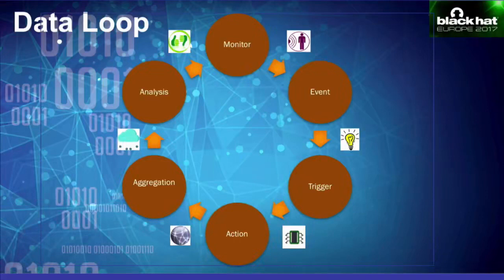That data is then passed on to something called an event architecture. What the event architecture module does is constantly analyze that data, and if it sees a deviation from normality, it can trigger an alert, and using the on-chip board, that can create an action. The action could be injecting an appropriate amount of insulin into a human's body.